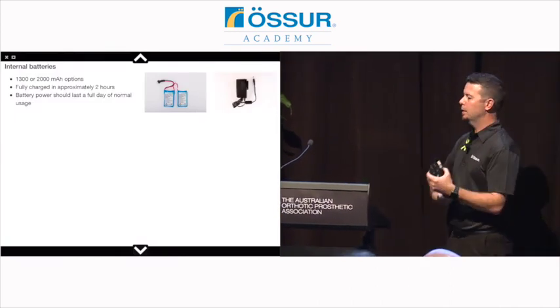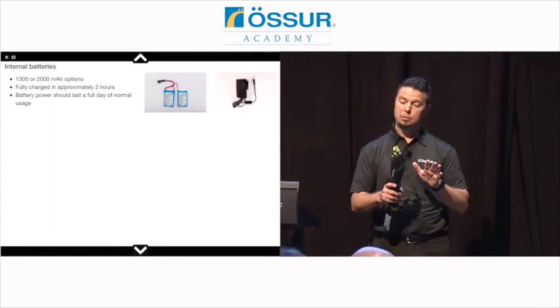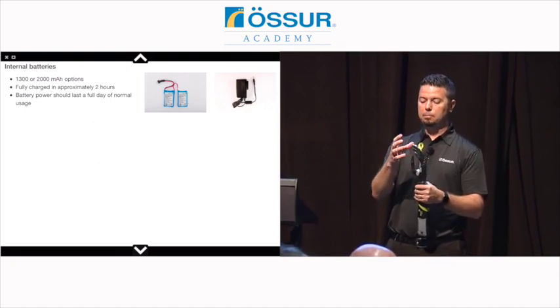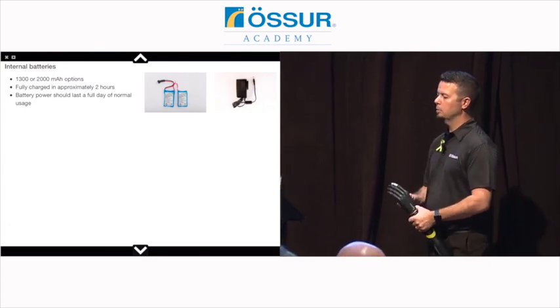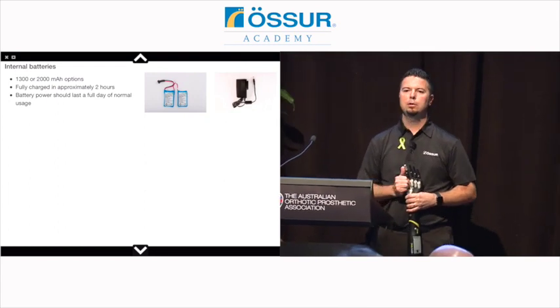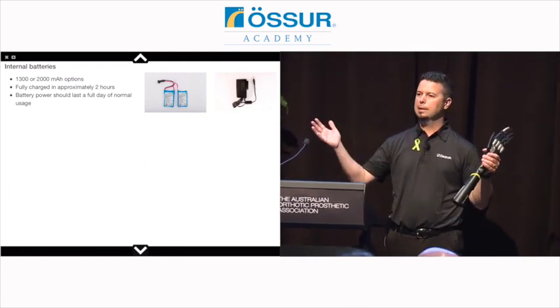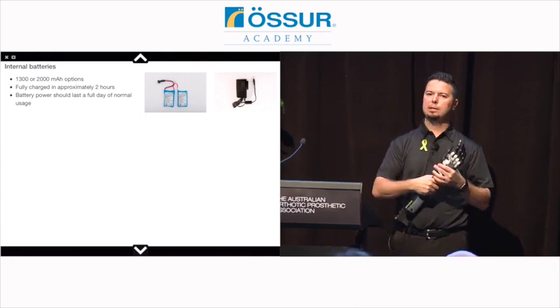And then batteries, we recommend internal batteries, and that's because we have 6 motors in the Quantum, 5 motors in the Access, that are pulling power. And your best, most efficient storage of power is going to be with one of our internal batteries. These batteries come in 1,300 or 2,000 milliamp hours. Just know that means how big is the gas tank? 1,300 is smaller size, but it's just going to hold less energy.